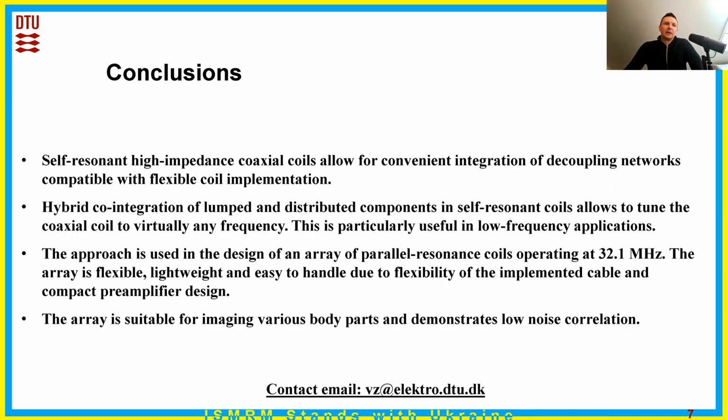In conclusion, self-resonant high-impedance coaxial coils allow for convenient integration of the decoupling networks compatible with the flexible coil implementation. Hybrid co-integration of lumped and distributed components in self-resonant coils allows to tune the coaxial coil to virtually any frequency. This is particularly useful in low-frequency applications.